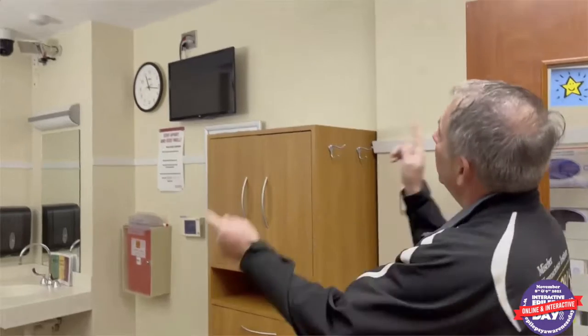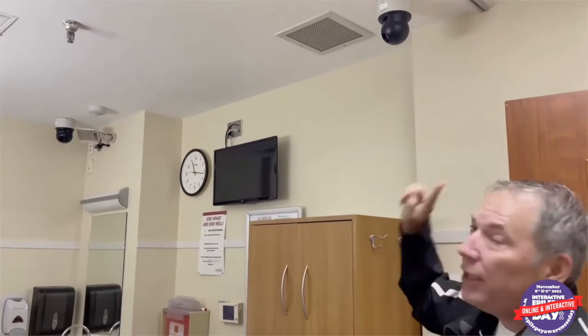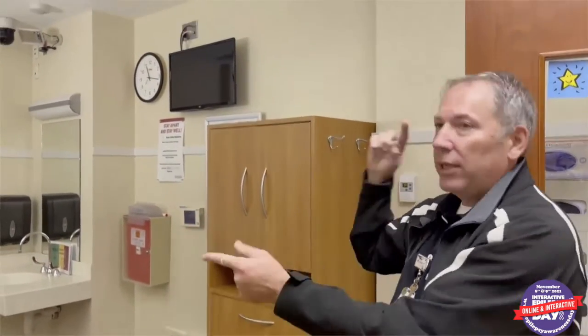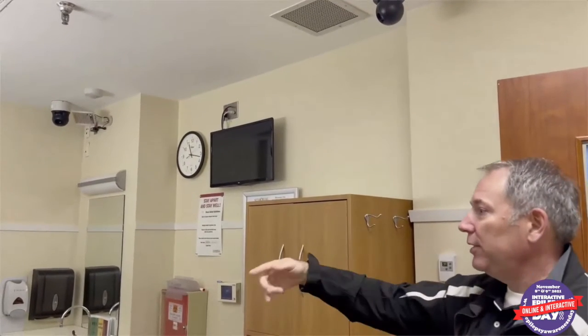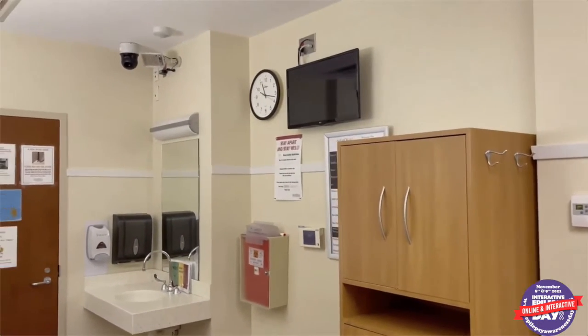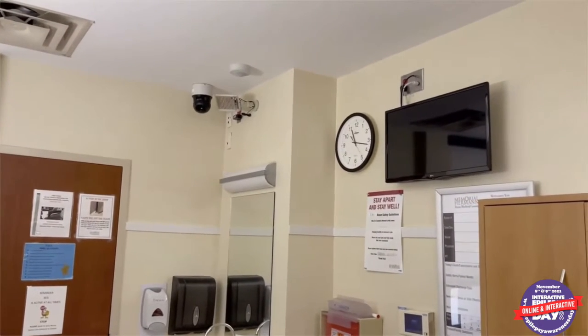Another aspect of this room is, as I mentioned earlier, us nurses looking at the patient's condition. Some of those seizures are very obvious on camera, and we jump in. Some of them are not so obvious, but this is happening with these 2 cameras, one in each corner, and they can alternate between the 2. As we assist the patient during the seizure, we'll be at the patient's bedside. Sometimes the type of seizure is not conducive to seeing 100%, so we always have an excellent view of the patients because the cameras cross, and we can see if the patient is on one side or the other. There's also a module for night vision, as sometimes seizures happen quickly at night, and we always have a good view of what's going on.